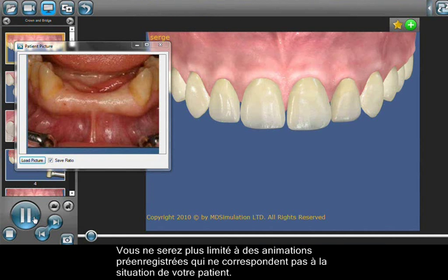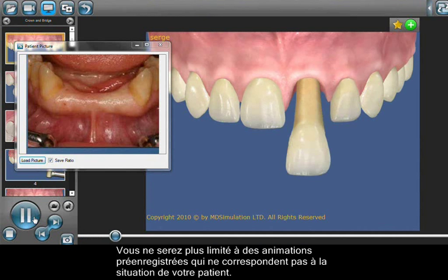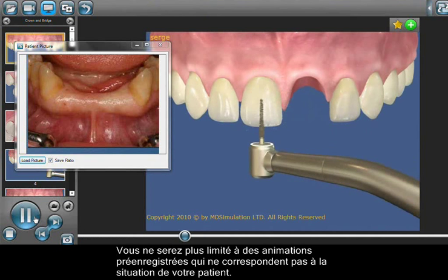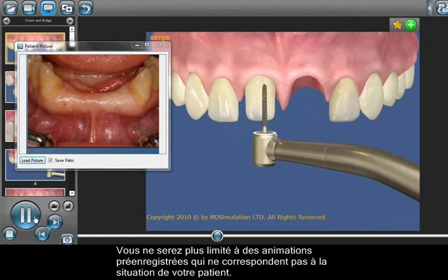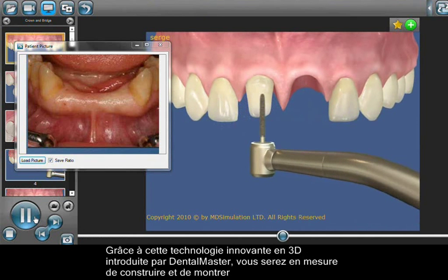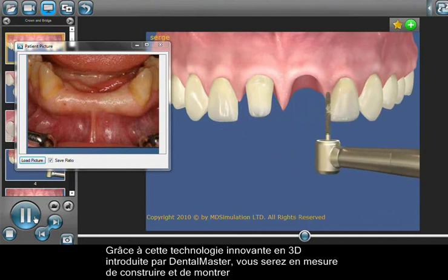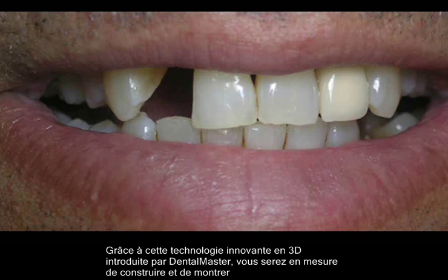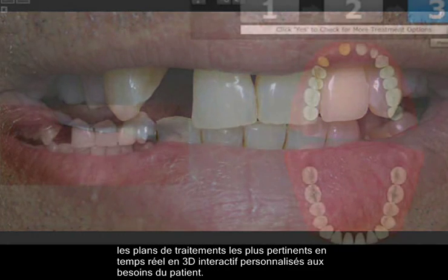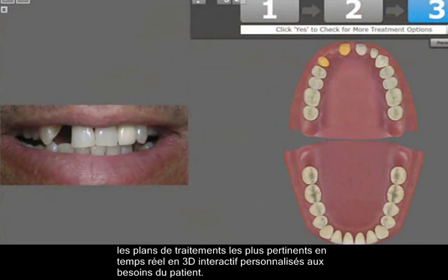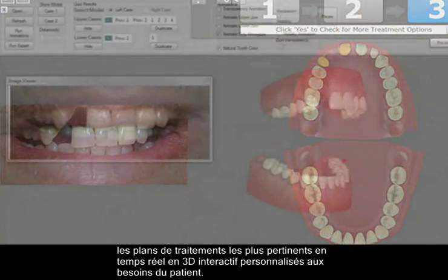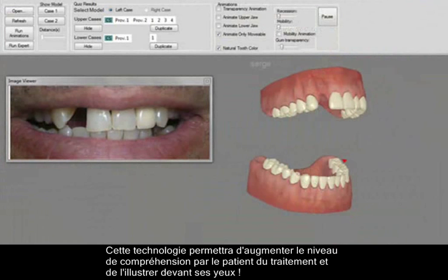As of today, you will no longer be limited to pre-recorded animations that may not match the dental situation of your patient. With this innovative 3D technology introduced by Dental Master, you will be able to build and show the most relevant treatment plans in real interactive 3D, customized to your patient's needs.